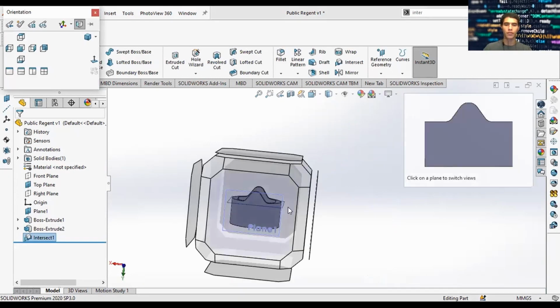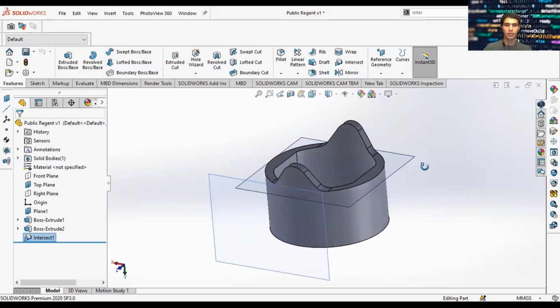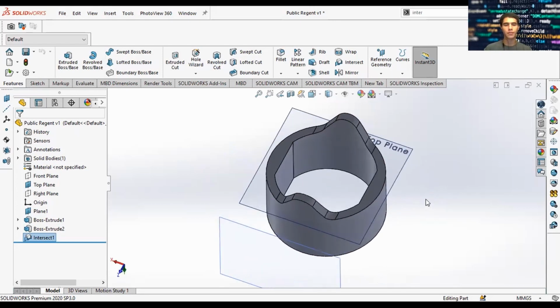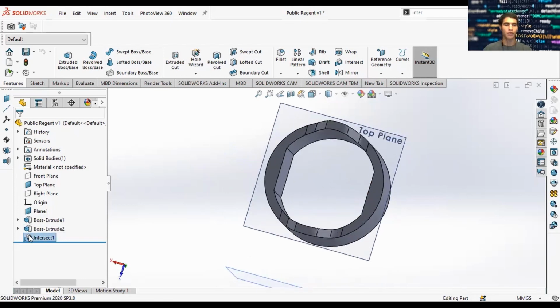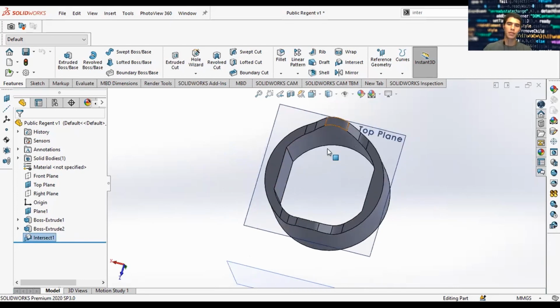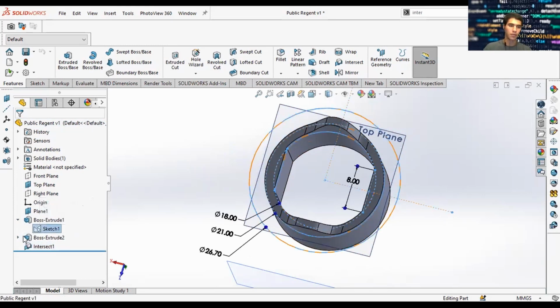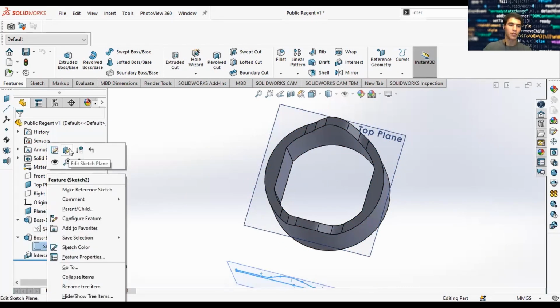So this is the bulk of the work, just getting this outline, and you can do that pretty quick using intersect bodies. So next thing you want to do is you want to create the profile for actually the leaflets. Let me update something, because these leaflets are supposed to be aligned with this flat face. So what we can do to fix that is we'll go to our sketches, change the plane, edit sketch plane.